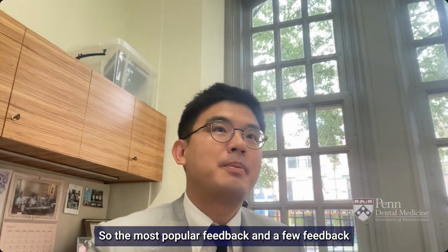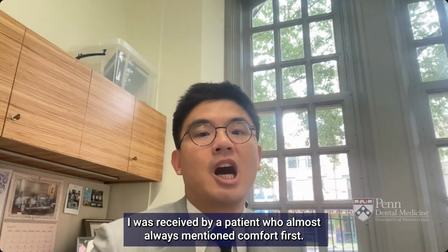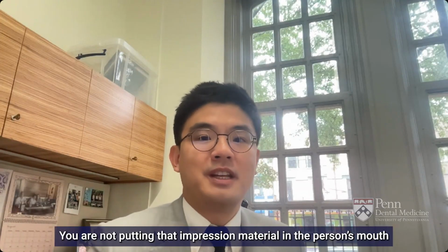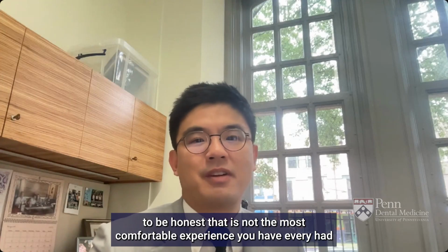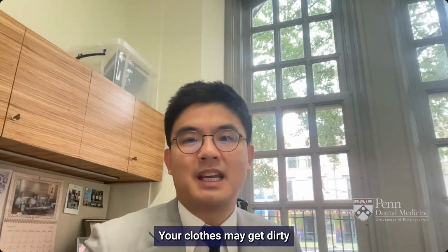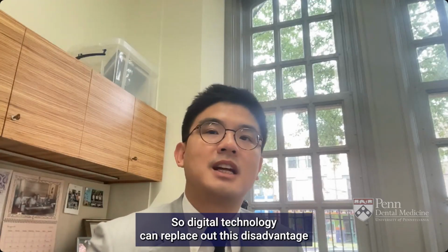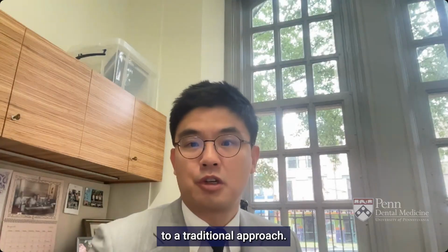So the most popular feedback I have received from patients almost always mentions comfort first. Putting that impression material in the mouth, to be honest, is not the most comfortable experience you ever have. After removing it, a lot of the time your face is very messy and your clothes may get dirty. So digital technology can replace all these disadvantages of the traditional approach.